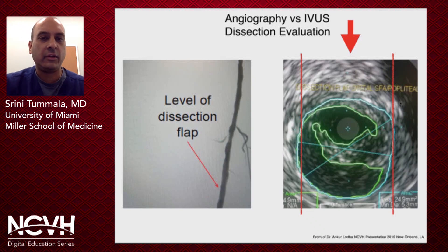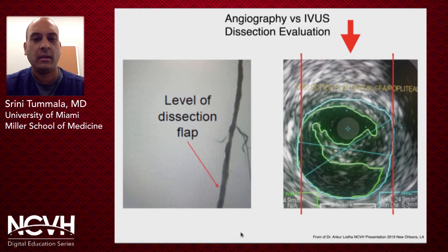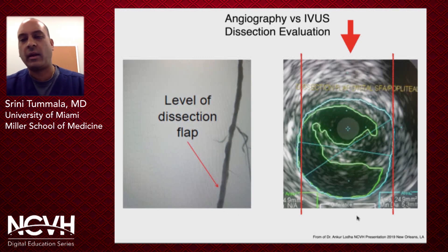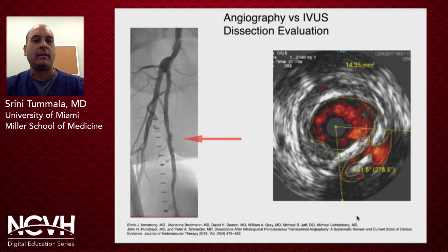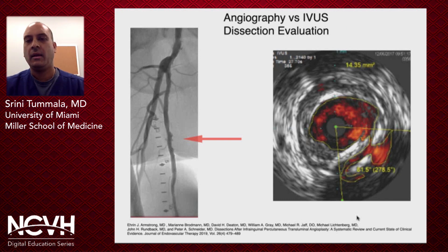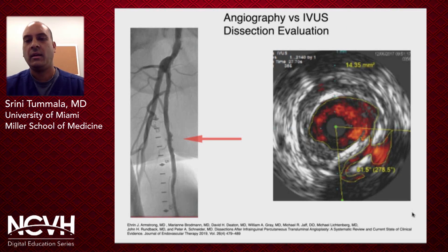Looking at examples: an angiogram without significant flow limitation looks pretty good on static imaging with no significant dissection visible, but the IVUS image shows not only a significant arterial dissection but also significant luminal compromise, which impacts patency rate and may result in thrombosis. Another angiogram looks pretty good with a little bit of plaque but no significant focal stenosis or dissection flap, yet IVUS reveals a significant dissection, luminal compromise, and a combination of soft and calcified atherosclerotic plaque — therapy has not been optimized.